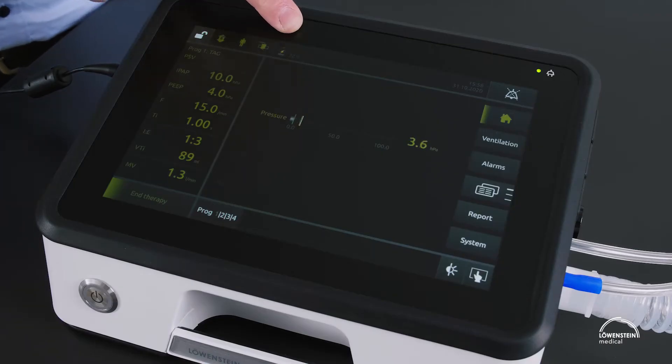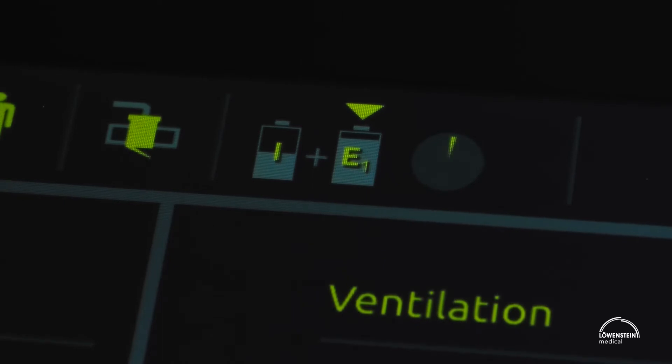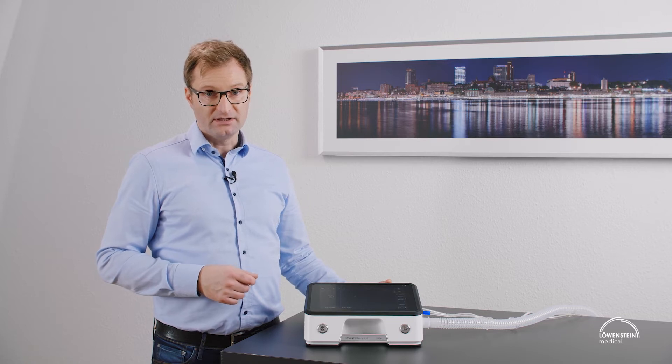Next to it is the battery indicator. As long as the device is on mains, the capacity will be displayed in percentage. After disconnecting the mains and waiting two to three minutes, the remaining battery capacity is displayed in hours and minutes.